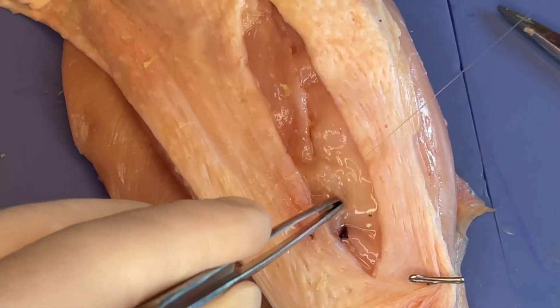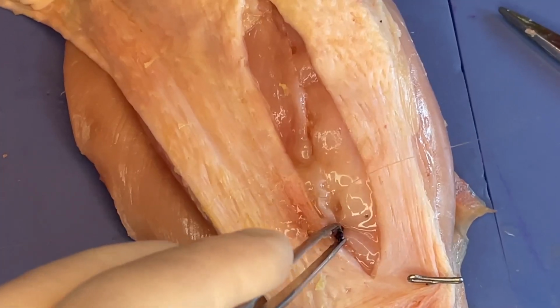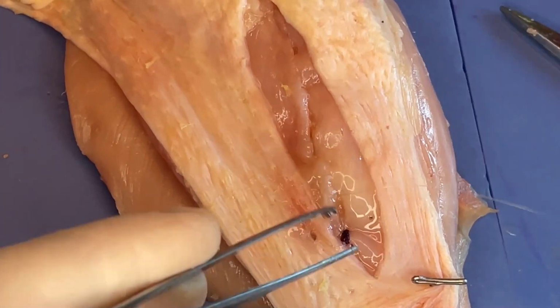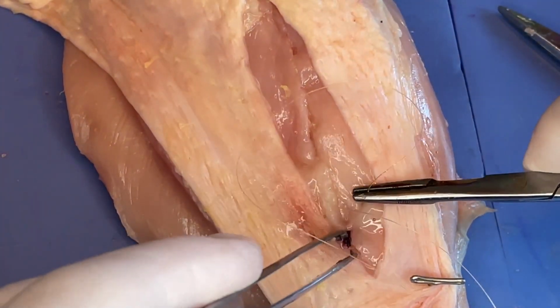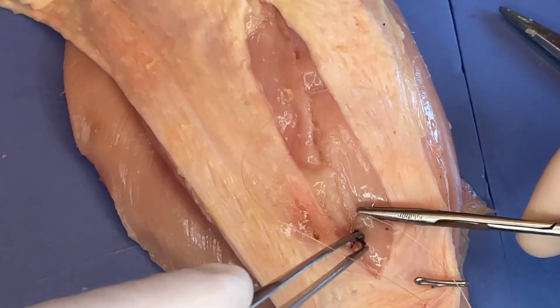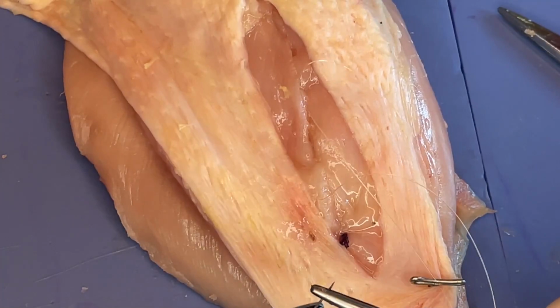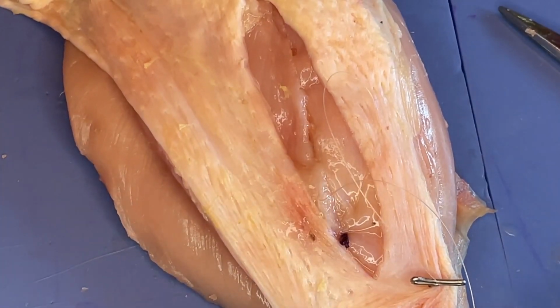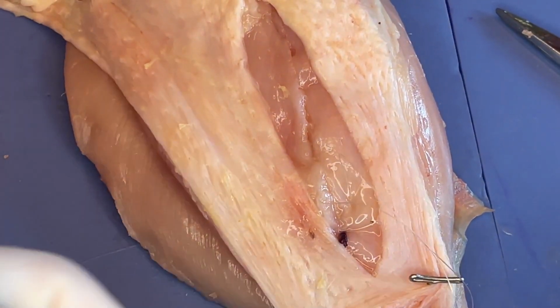All right. And then as we're getting down here towards the end of the defect, you can see where our knot is here from that buried knot that we placed. We would come just right to the end. So we're going to do one more here, probably on each side. Oh, I forgot to use my finer Adson-like pickup.